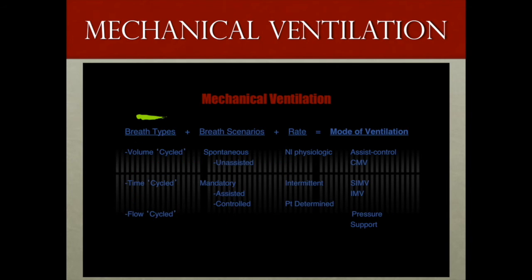So if you remember your breath types, your breath scenarios, and your rate options, and you mix and match your choices, you can build different modes. And the most common and most basic modes that you will see will be assist control and its 2 subsets, volume control and pressure control. And if they're fully supported without any assist, it would be called, again, complete mechanical ventilation. IMV and SIMV, and again, you really won't see IMV used anymore. It's all synchronized now. And pressure support.